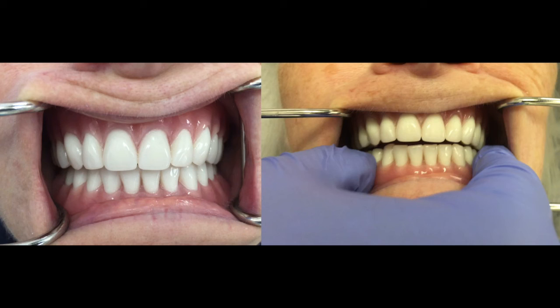So these two have one difference. The left video is taken without any denture held in place in the mandibular. On the right side, you notice very obviously the occlusion is off because I was holding the mandibular denture in place.